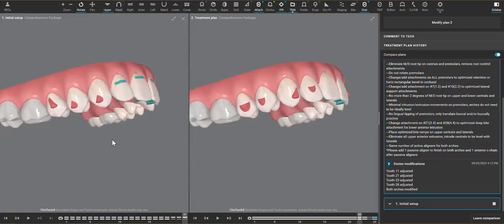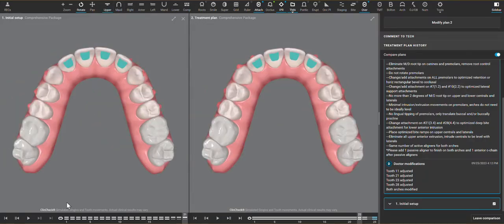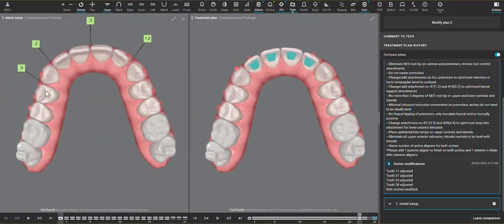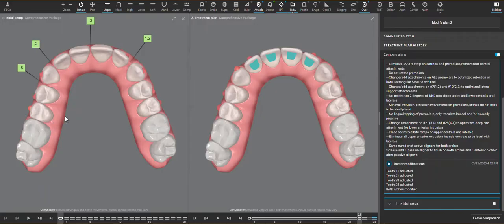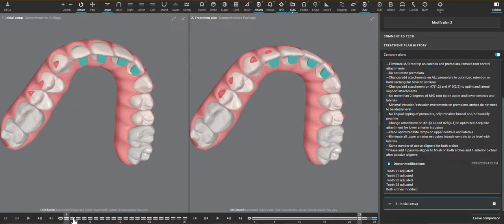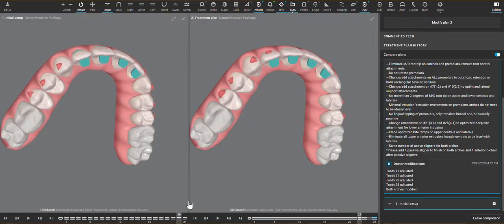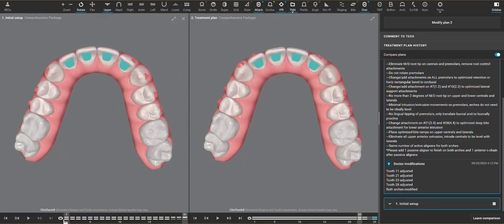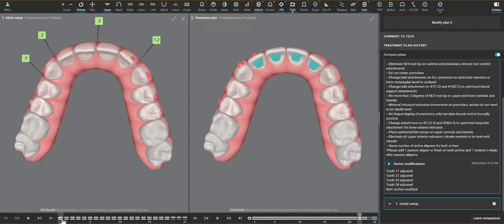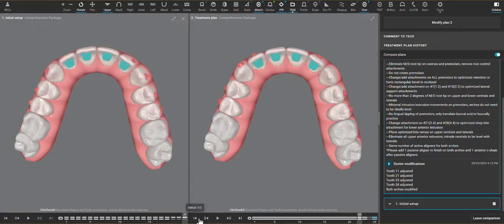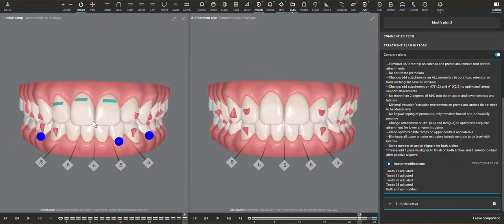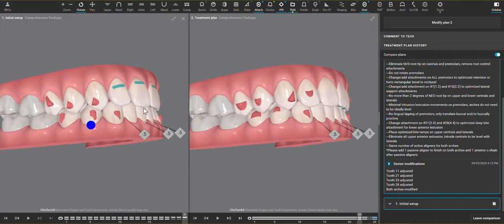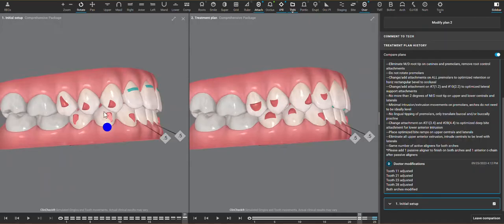Then I do a systematic approach of looking at the premolars and although these premolars are rotated and this Invisalign ClinCheck software will do rotation movements to get them to perfect, clinically, in this case, it doesn't make a lot of sense to do those rotations because they take up less space in the arch. And then we would have an even harder time getting into a better overjet and resolving the deep bite.